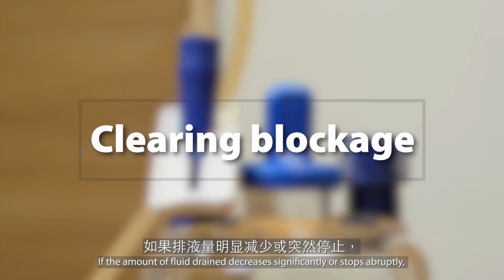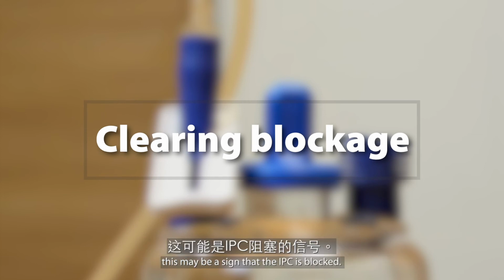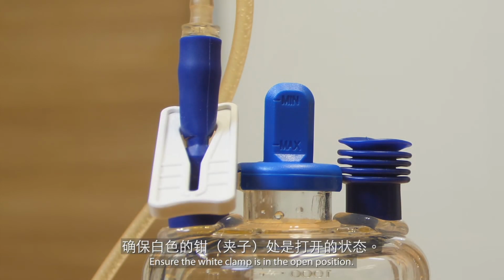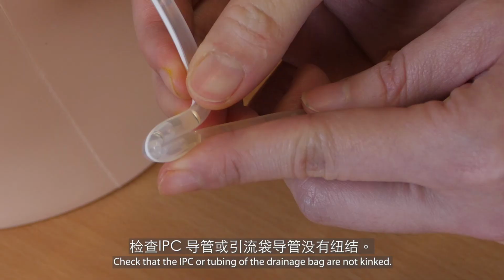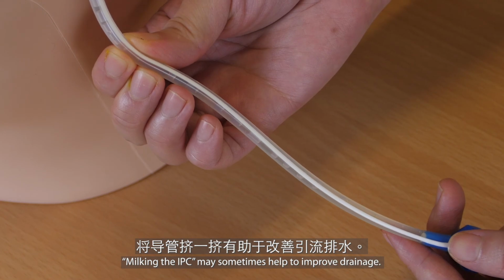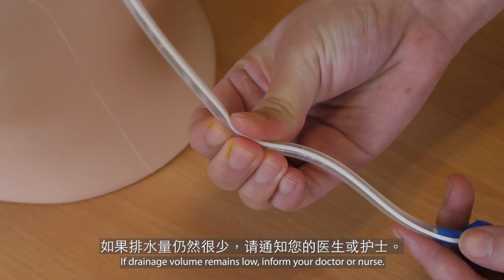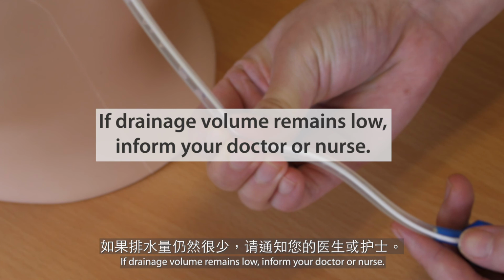If the amount of fluid drained decreases significantly or stops abruptly, this may be a sign that the IPC is blocked. Ensure the white clamp is in the open position. Check that the IPC or tubing of the drainage bag are not kinked. Milking the IPC may sometimes help to improve drainage. If drainage volume remains low, inform your doctor or nurse.